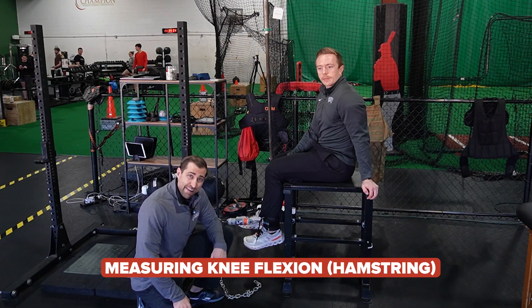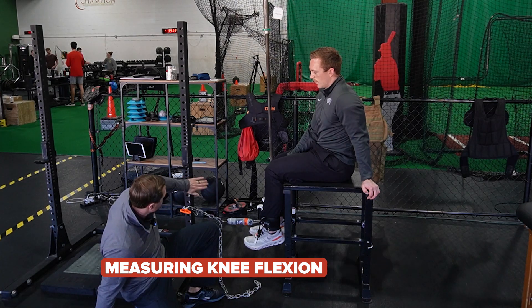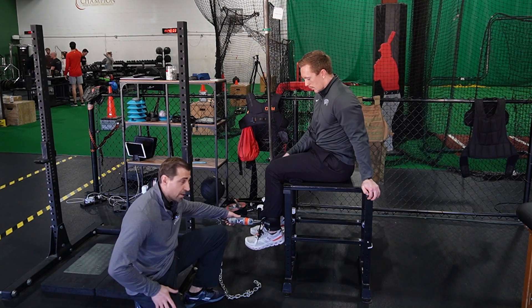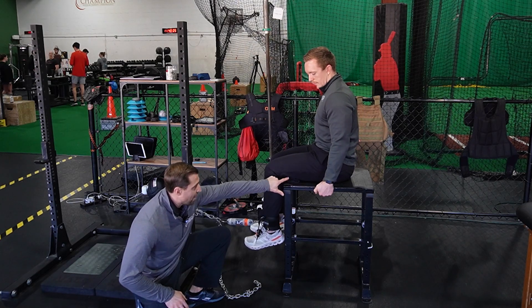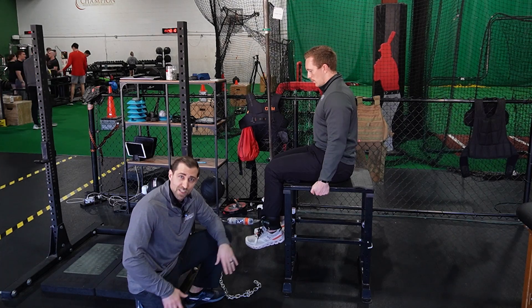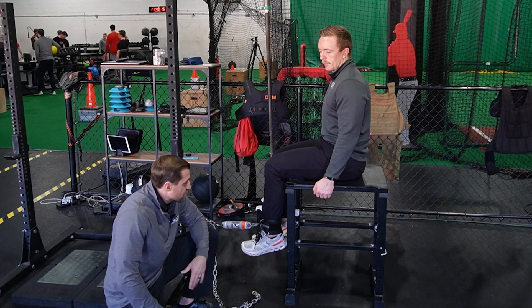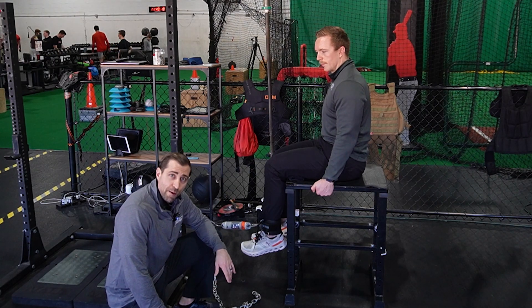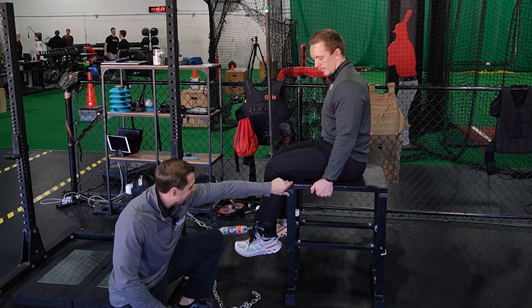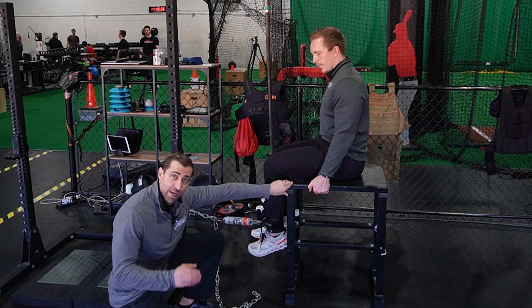To measure the hamstrings or knee flexion, it's the same setup as knee extension but flipped. We have a chain to something stationary, the handheld dynamometer, Jacob sitting with a towel underneath the knee, at 90 degrees — which is important so we can measure torque, although torque is probably not as critical for the hamstring as it is for the quad. The cueing and warmup are the same. For peak force, have the athlete push lightly into the resistance, then push as hard as they can.